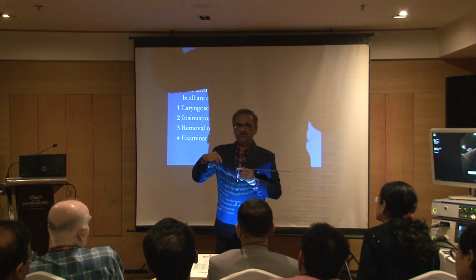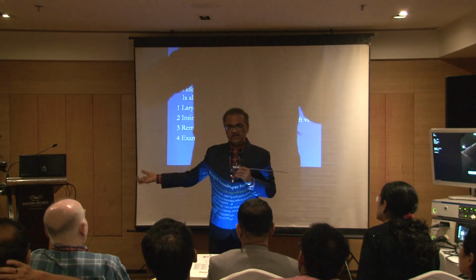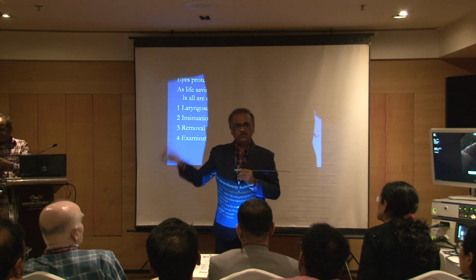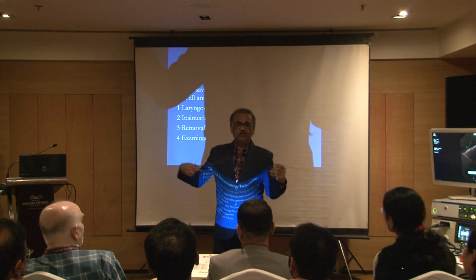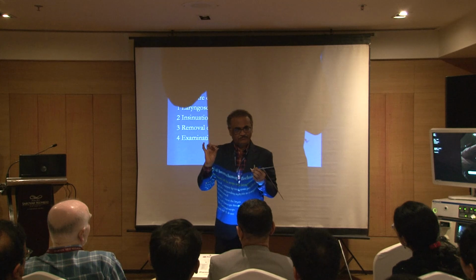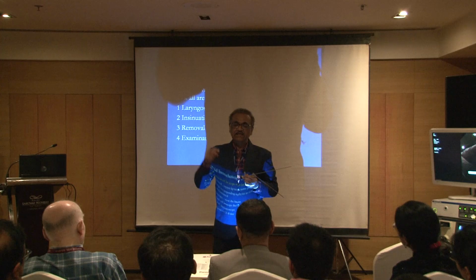Now what I am saying is, what I'll do in most of the cases, if the patient is very much hypoxic, I'll go with a straight non-ventilating forceps, look into it, take out the foreign body, and the remnant of the foreign body or second foreign body or recheck scopy, I'll do with the telescope. So that time I will not be using this forceps. I'll be using the telescope just to see. The technique of scopy is inspection first, draining secretions, looking for foreign body, then extraction, and then re-inspection.